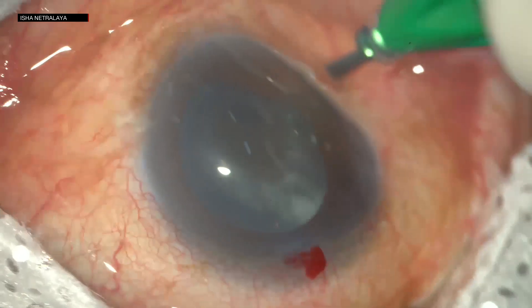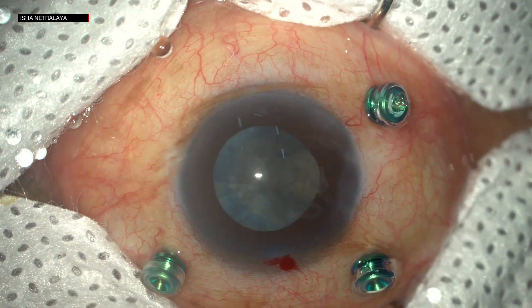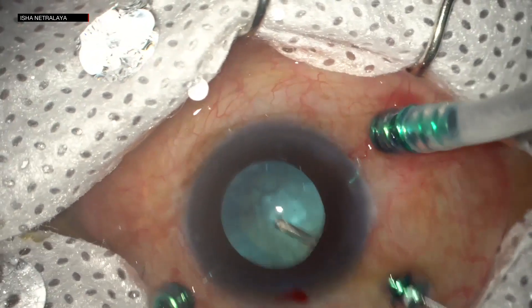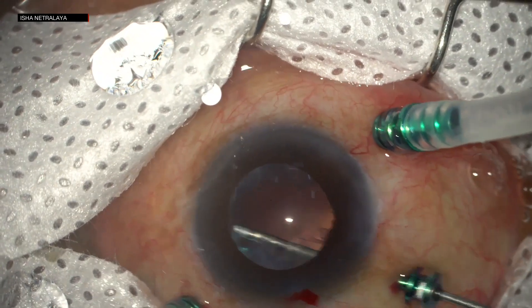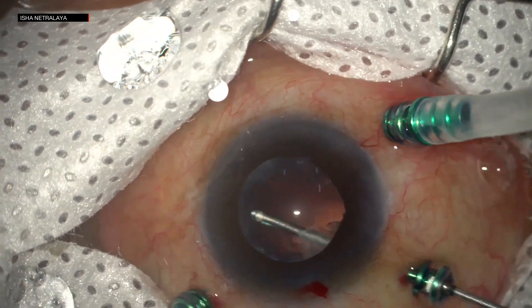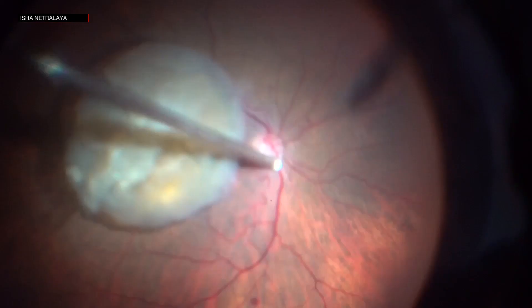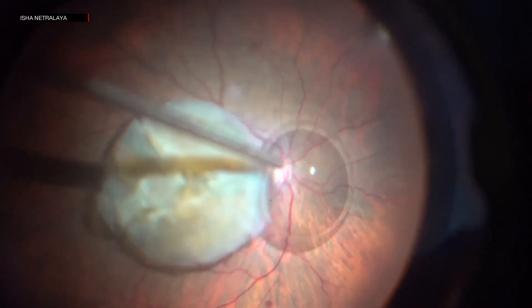Coming to the management of the cases: 3-port 23-gauge sclerotomies were done. The cortex was cleared. Vitrectomy was started. PVD was induced. PFCL was injected over the posterior pole to protect the macula.